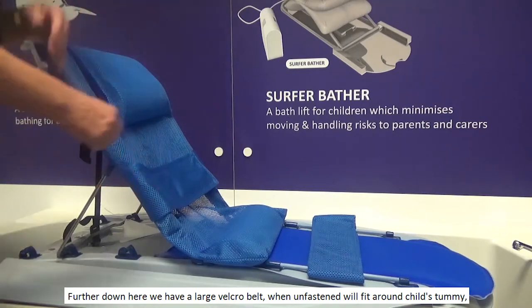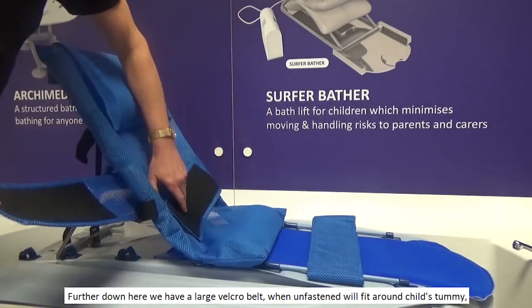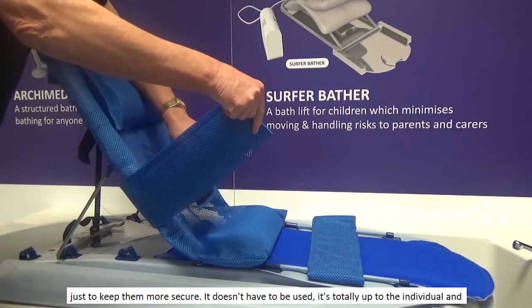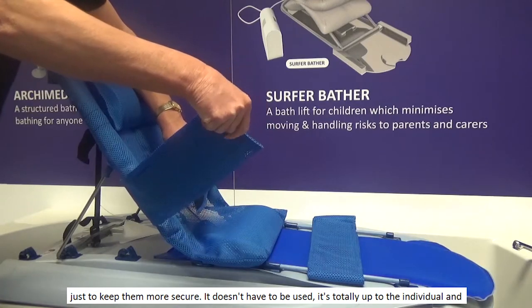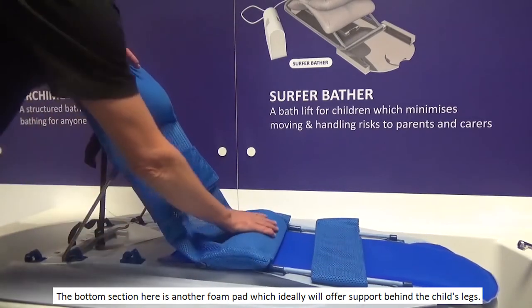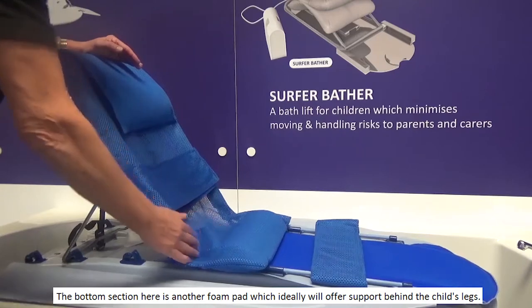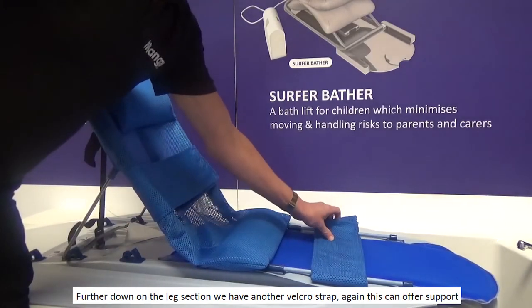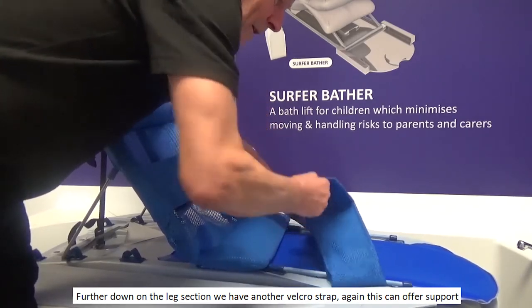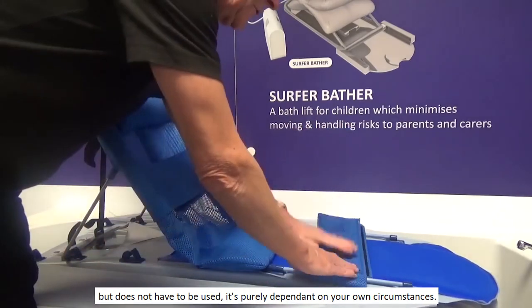Further down, we have a large Velcro belt which, when unfastened, will fit around the child's tummy just to keep them more secure. It doesn't have to be used — it's totally up to the individual and the circumstances. The bottom section here is another foam pad, which will offer support behind the child's legs. Further down on the leg section, we have another Velcro strap, which can offer support but does not have to be used. It's purely dependent upon your own circumstances.